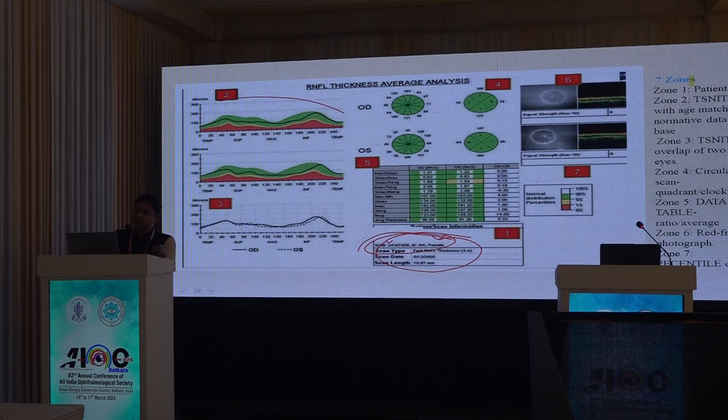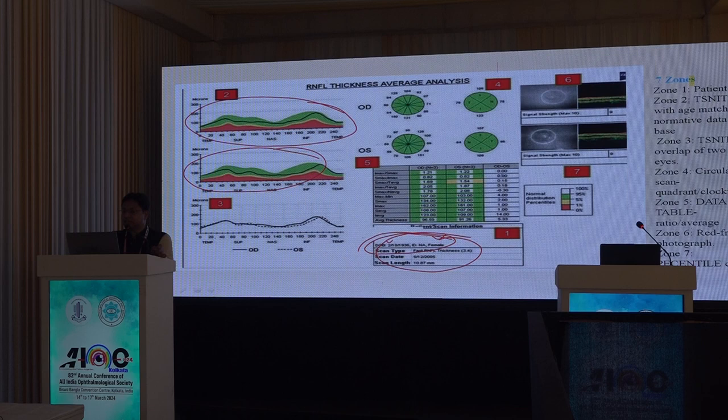Check that the RNFL report belongs to the correct patient — it is important to verify patient ID on the printout, as a technician may inadvertently give the wrong patient's RNFL report. The normative database and double-hump pattern are presented for each eye.